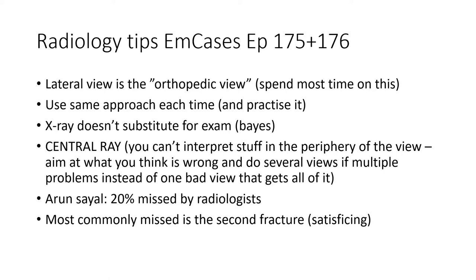That's a cognitive bias. We should be systematic, using our system two, like the first A in our AAABC's approach to the x-ray. The first A is really important. This is our gestalt. What is really important here, and what is obvious? Then you go for that, and then you use your system two in the rest of the x-ray. And just like reading an ECG, the more you do it, the better you become. And then after a while, your system two becomes your system one.